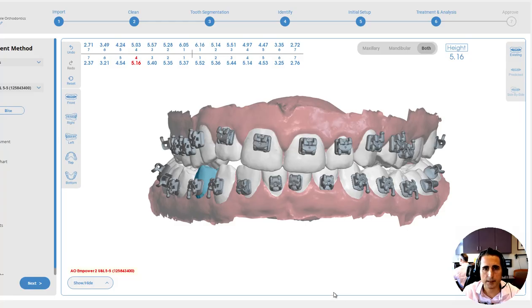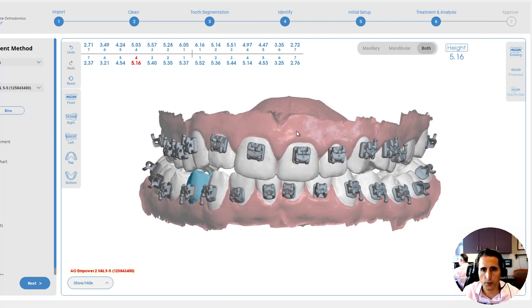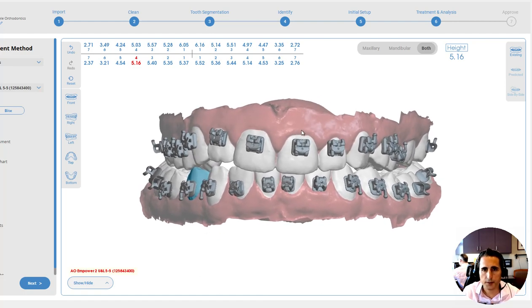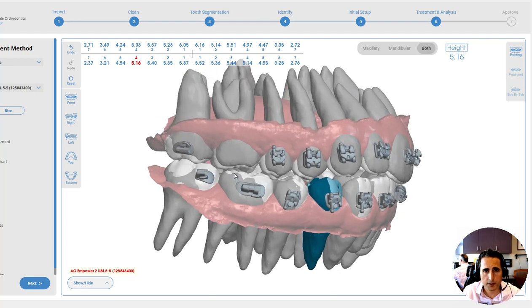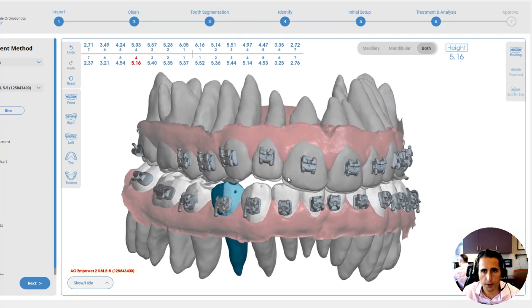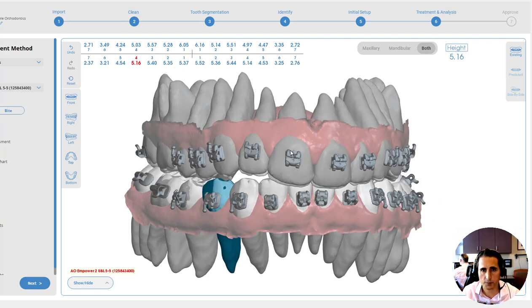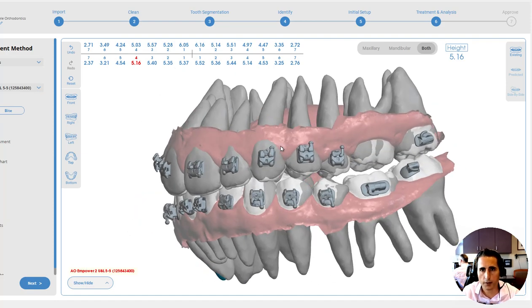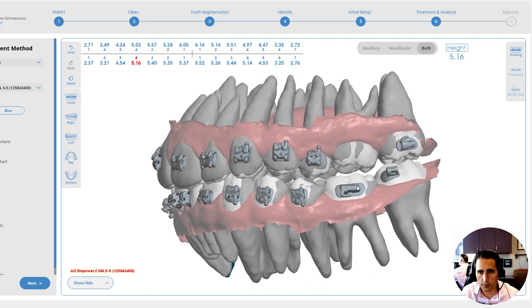The next question is how do we set up a case like this? When looking at where we want to place these brackets, in general I always want to get the teeth as level with the bone as possible. You can see the difference in the anterior teeth — how they're slanted to the right side. The roots come in handy for these cases. The first thing I'm going to do is look at the roots and make sure the bracket placement is roughly in the right orientation compared to the roots. You can see that cant on the upper anterior roots — those two to two — and we want those brackets to match that cant. Looking more toward the back, those are lined up pretty well, so we're not going to adjust those.